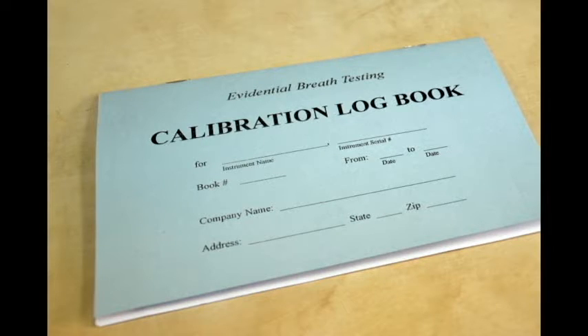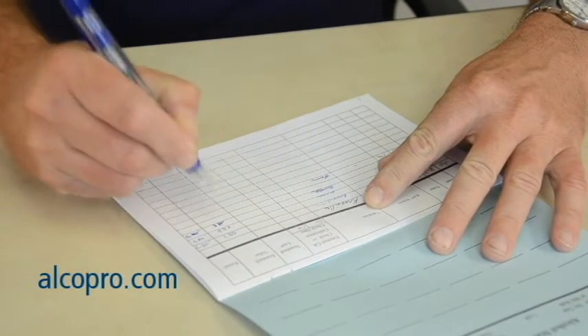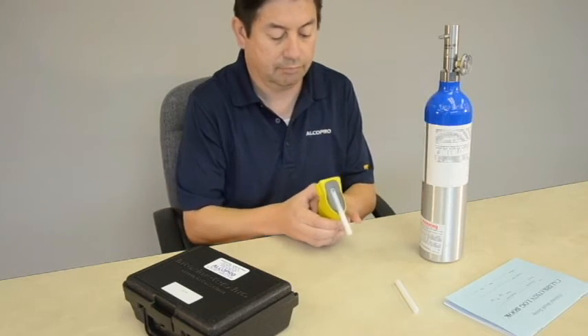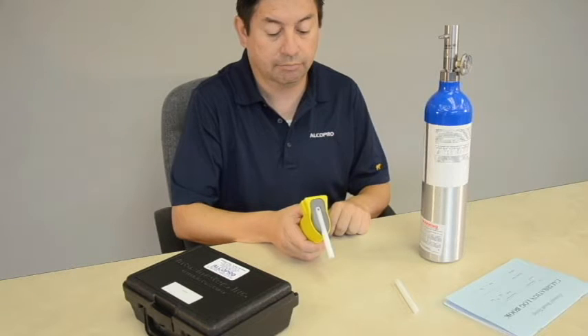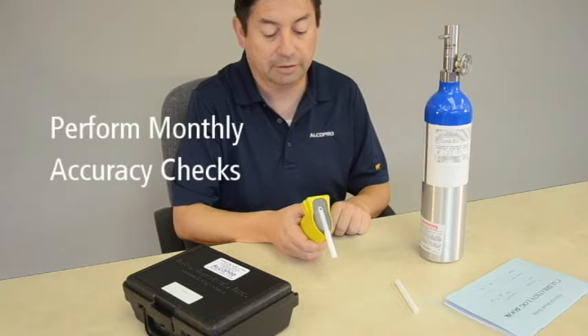It is a good idea to keep a logbook of accuracy checks and calibrations performed on your device. You can purchase an accuracy check calibration logbook at alcopro.com. An accuracy check is a test of your instrument's ability to read a known alcohol standard within a given tolerance level. A best practice is to perform accuracy checks once a month to document that your instrument is continuing to give accurate results.